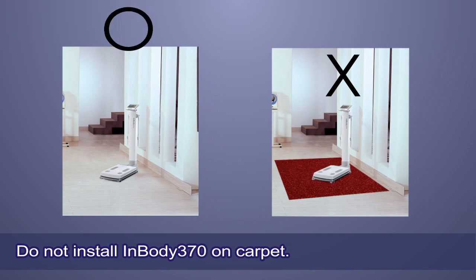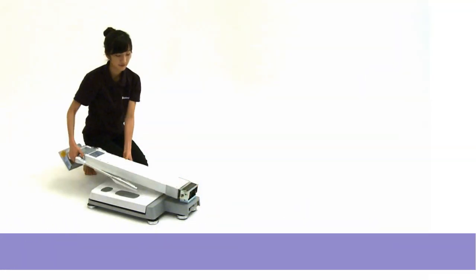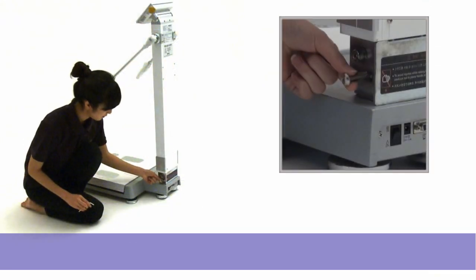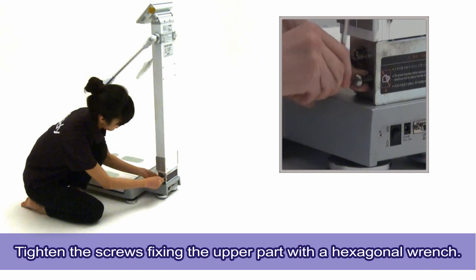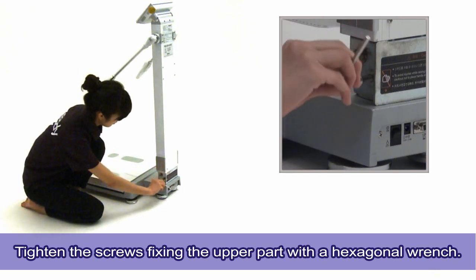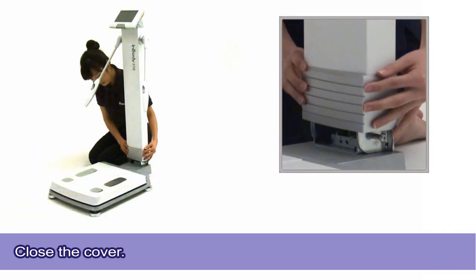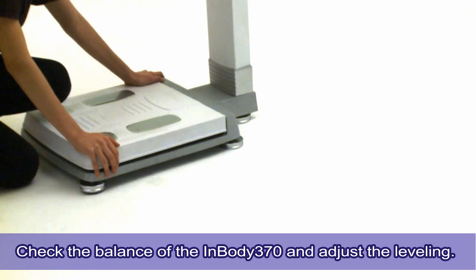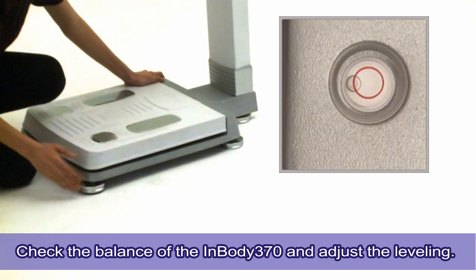Do not install InBody 370 on carpet. Static electricity may cause serious damage to the electronic components. Lift the InBody 370 up into a standing position. Tighten the screws fixing the upper part with a hexagonal wrench. Close the cover. Check the balance of the InBody with the built-in bubble level located in the top left of the footplate. To adjust the leveling, twist the foot supporters to lower or raise each corner of the base.